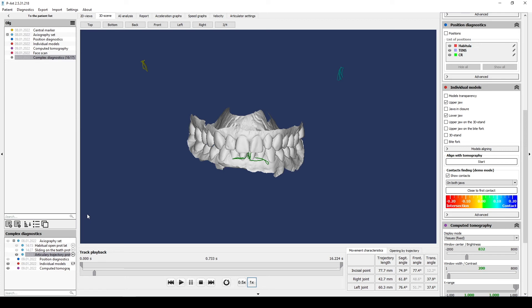After that you can add in articular analysis any type of trajectories like bruxing, speech and chewing. This list with three axiography is obligatory to record.